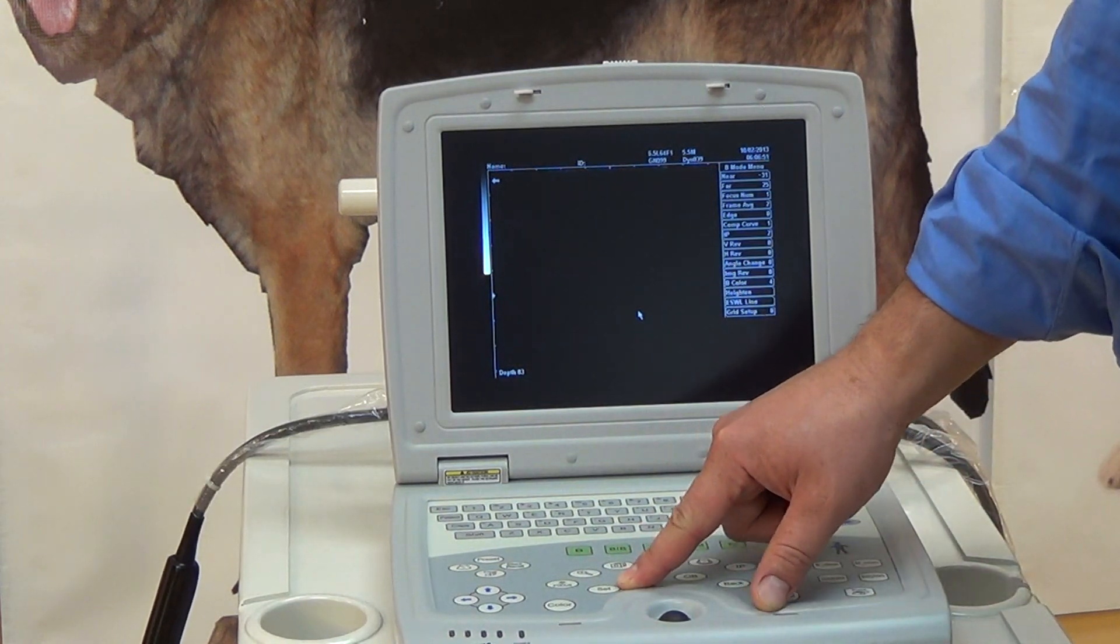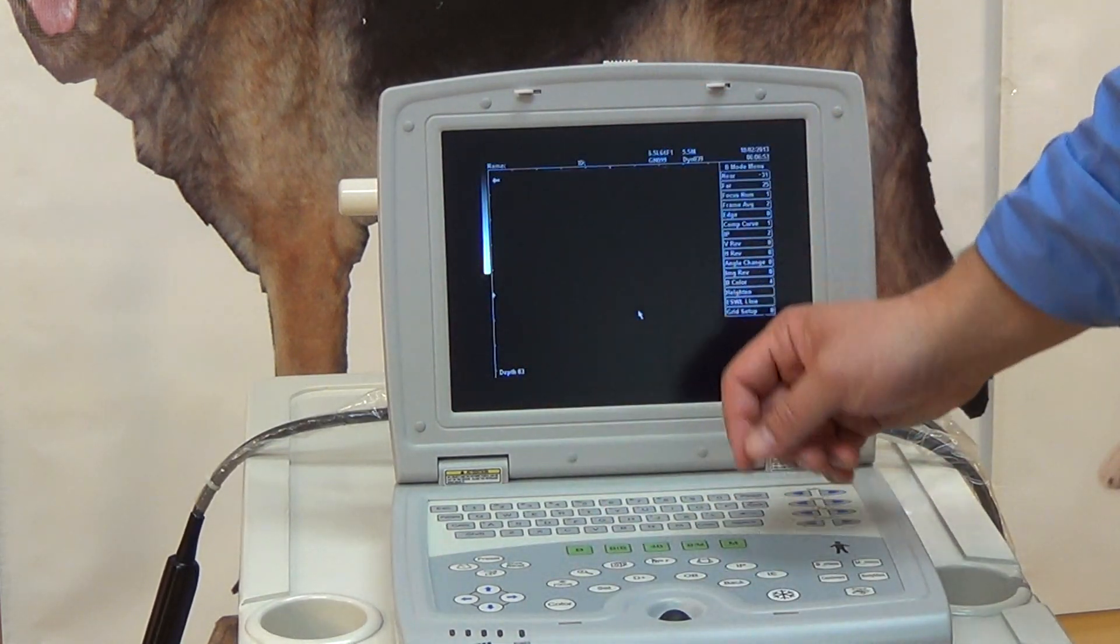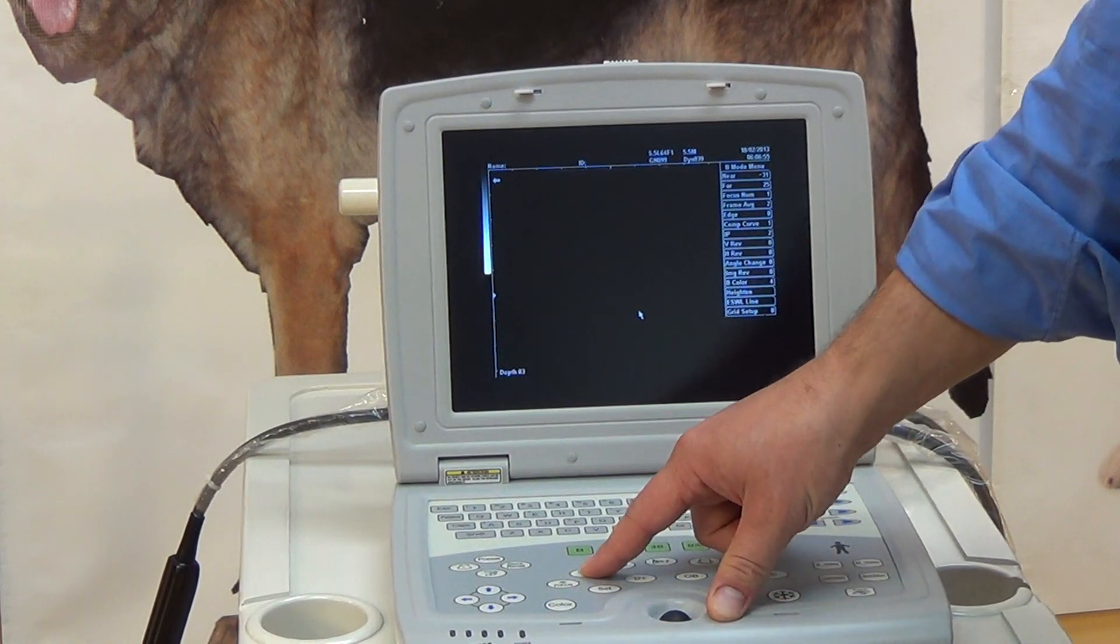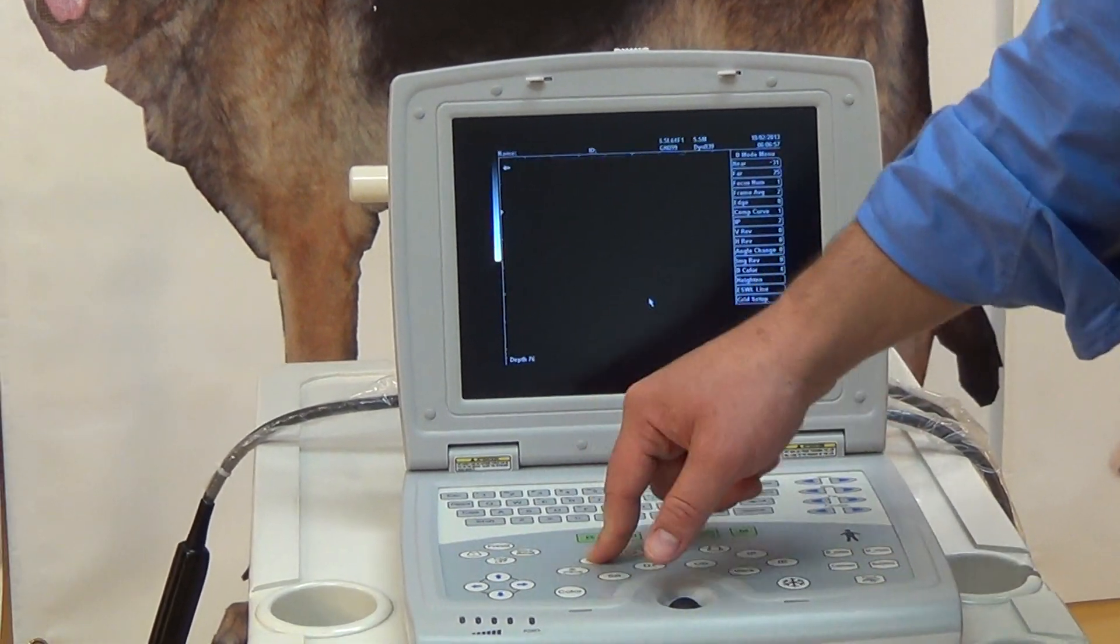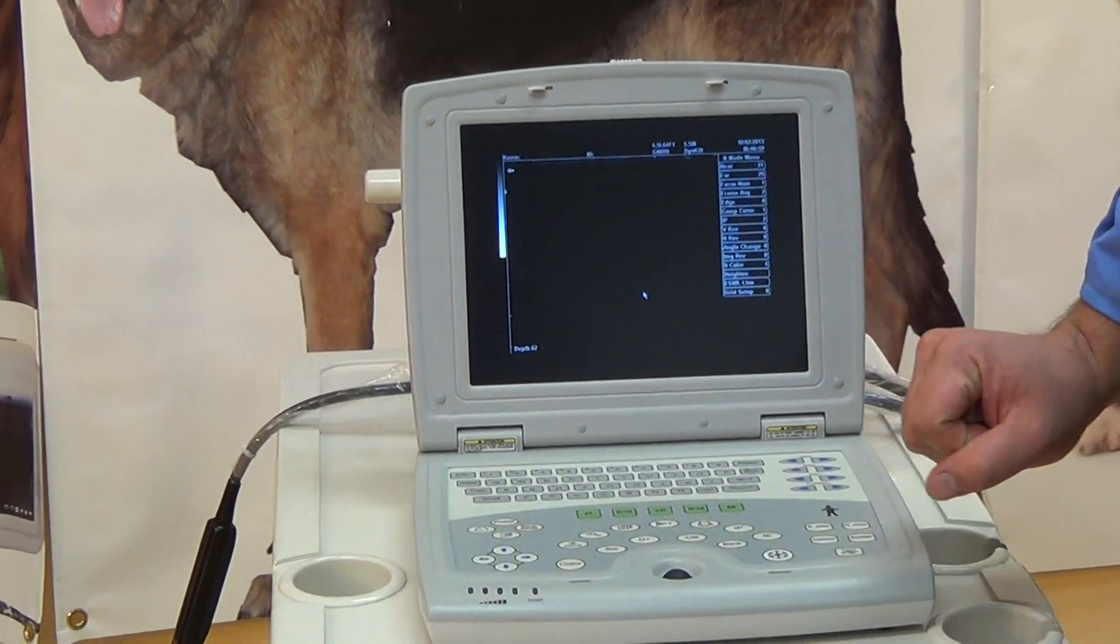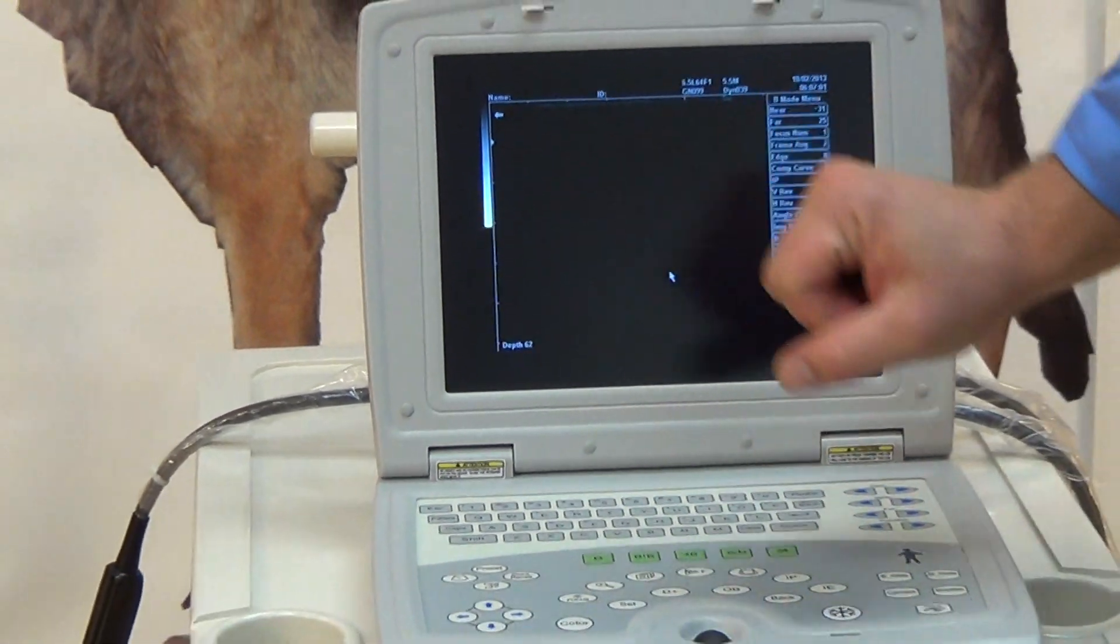We have our set button, which basically we use to set our measurements. This button here, magnifying glass, is somewhat self-explanatory. You zoom in. You can't really see it as well here because we don't have an image. But it just does an overall zoom.